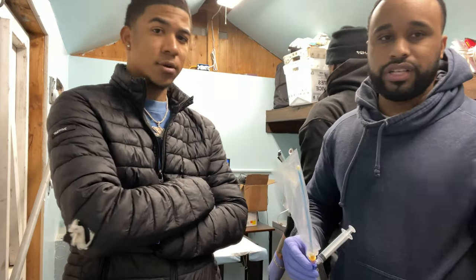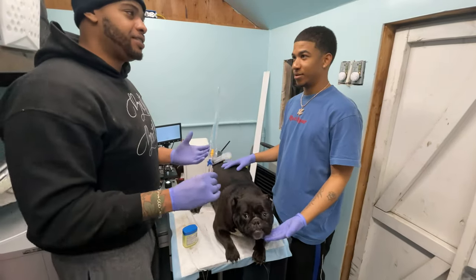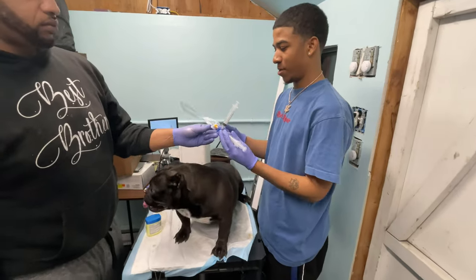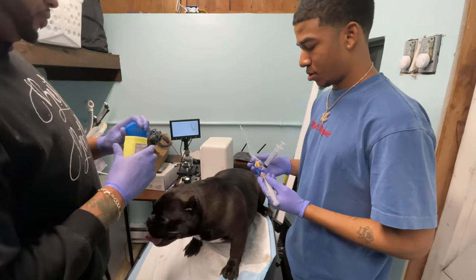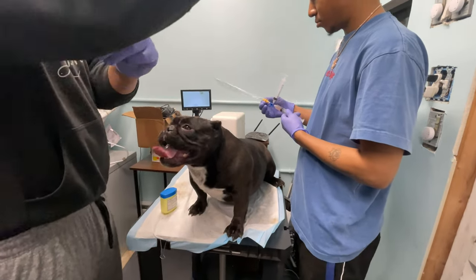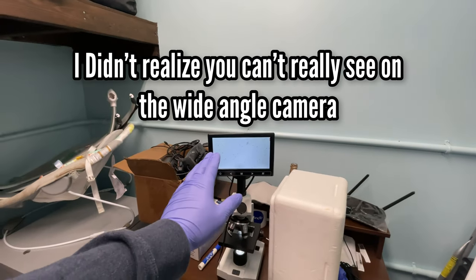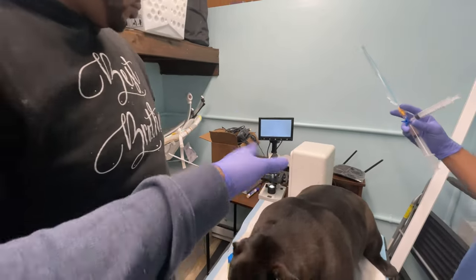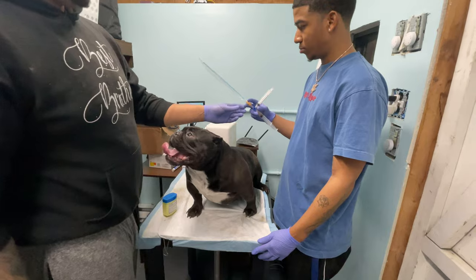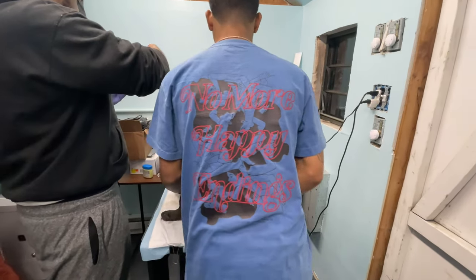Alright, let's get her set up and ready to go. Under the microscope it's looking really good — plenty of sperm moving all over the place, tails swimming straight. That's what you want to see. Now we've got Capri right here and we need to shift her body so her rear is facing this way.